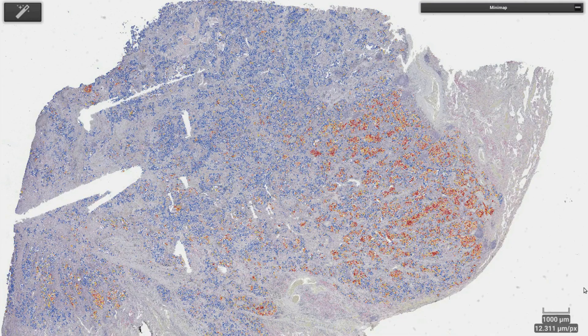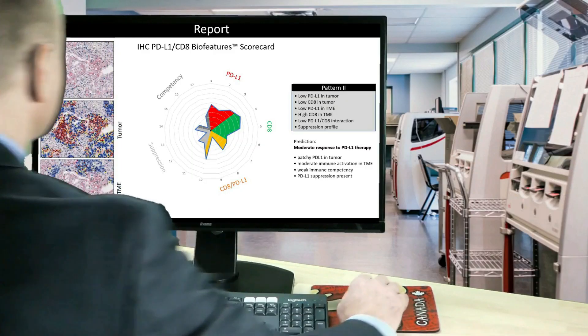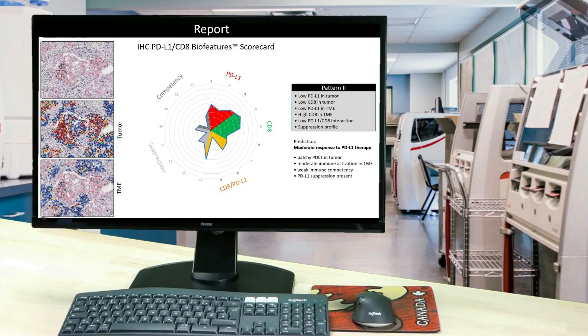The important biofeatures can be summarized in the form of scorecards. These immunograms are part of our standard Action.io product offering.